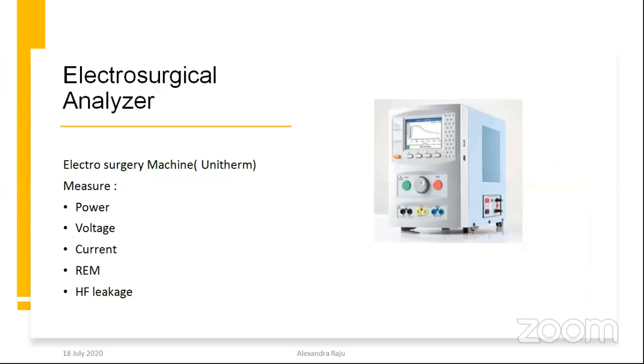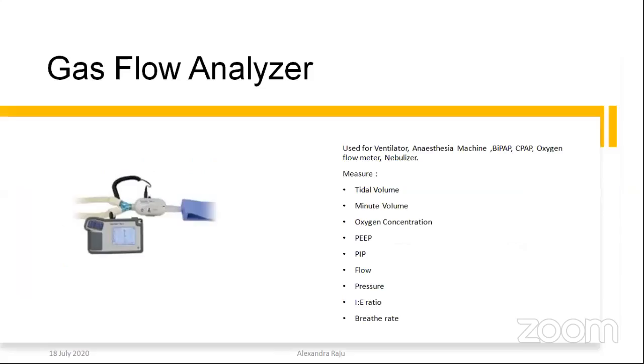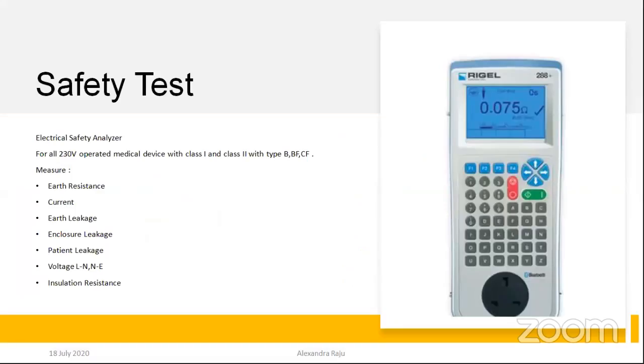Infusion pump analyzer is over. The electrosurgical analyzer is used for the electrosurgery unit. Next slide, sir. Then we also have the gas flow analyzer. It is mainly gas flow. No, previous slide, sir.